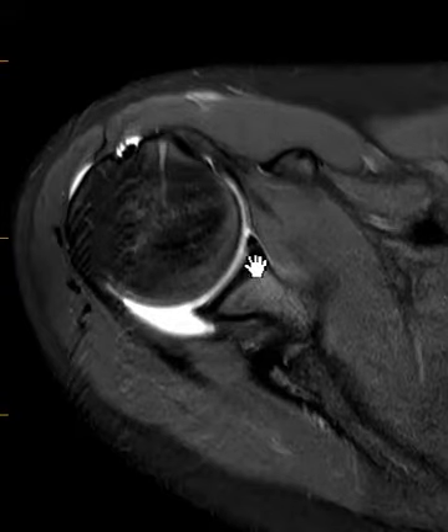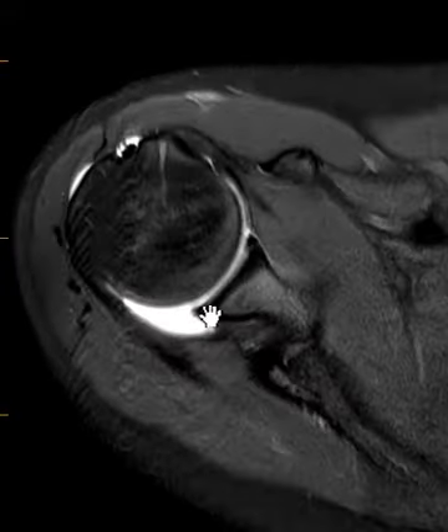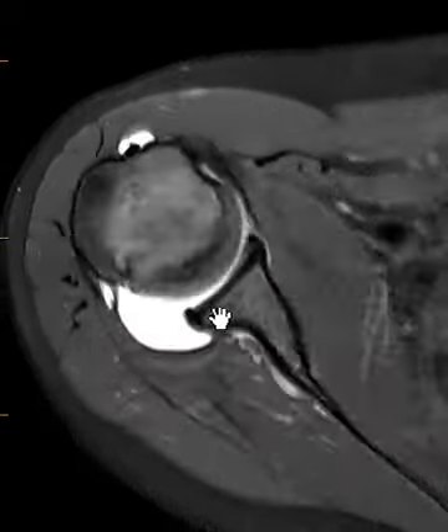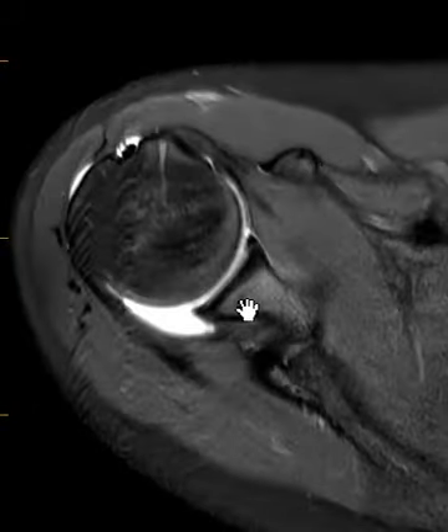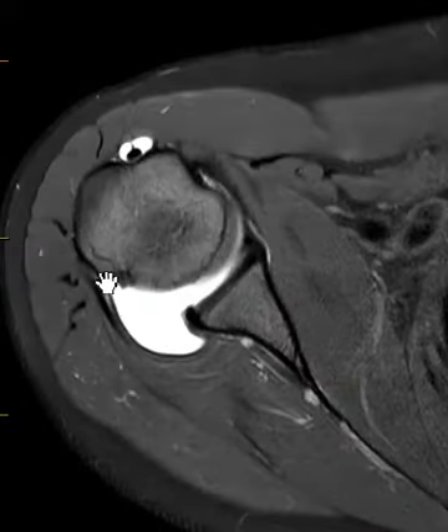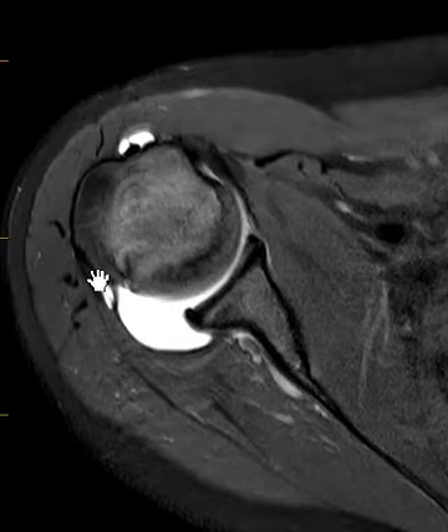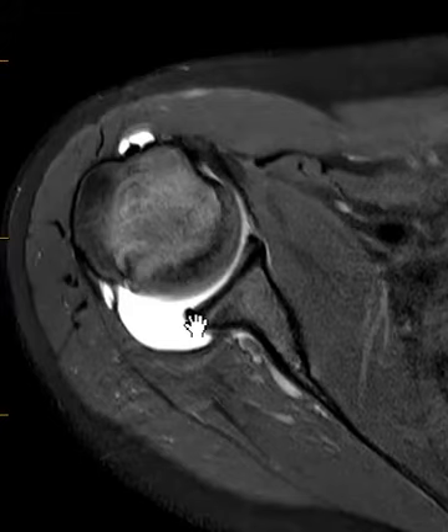So this is the round ball, the cup it sits and rotates in. The labrum is a little black wedge that goes around the rim of this cup. The labrum looks great. The only thing we really see is that the posterior joint bulges backwards, and this line is the posterior joint capsule that comes from the humeral head over to the glenoid.